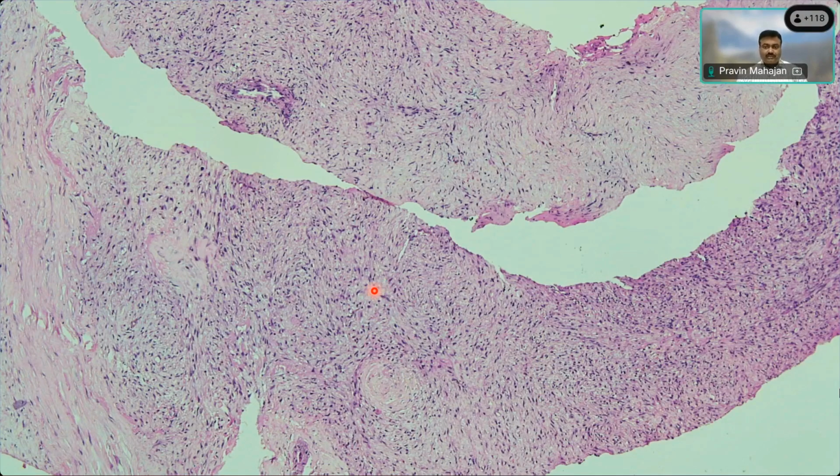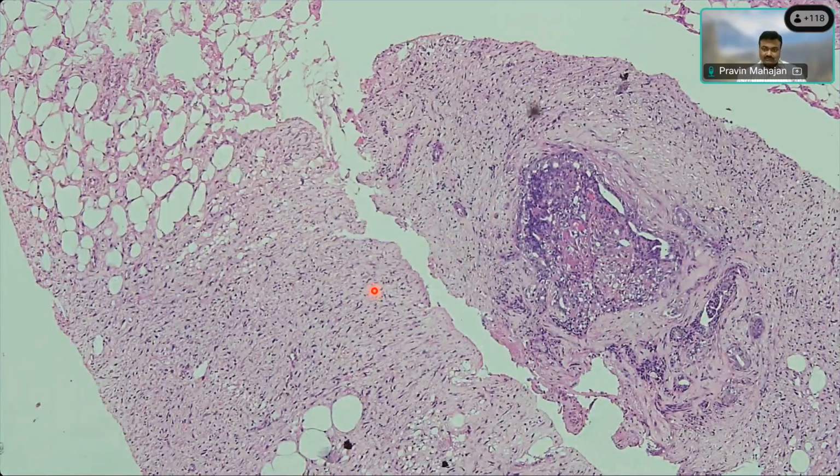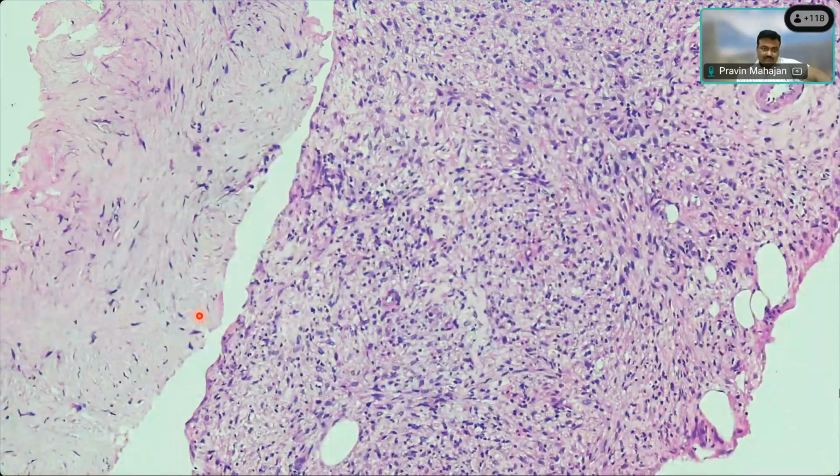Okay, very good. Yes. This is another area. So this is what I was saying. Whether you see anything to say it is a breast, you can see there is some duct-like structure. Maybe there is something happening within the duct, some proliferation. But this is the area of interest outside it, which you rightly said. There is some spindle cell proliferation within this collagenized or myxoid stroma, in hypercellular areas. What can you describe here?